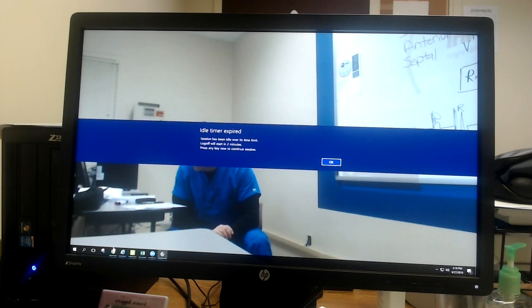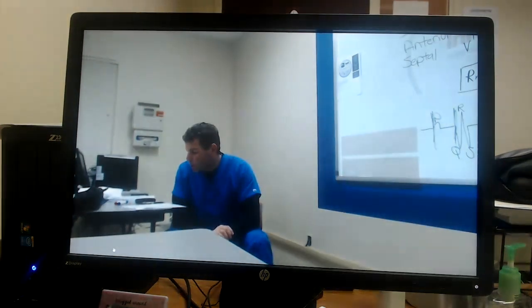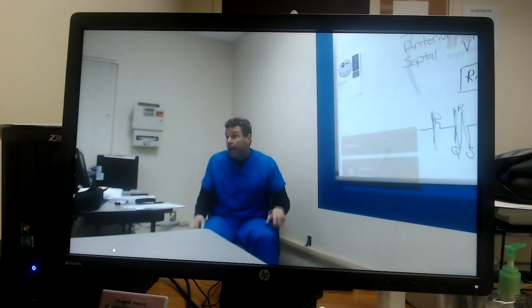A would probably result, right, in no reading. Okay, patient is cold and shivering. That's probably not going to create erratic spikes, though. Those would be almost like somatic tremor. If I'm shivering because I'm cold, it almost feels like somebody had Parkinson's.